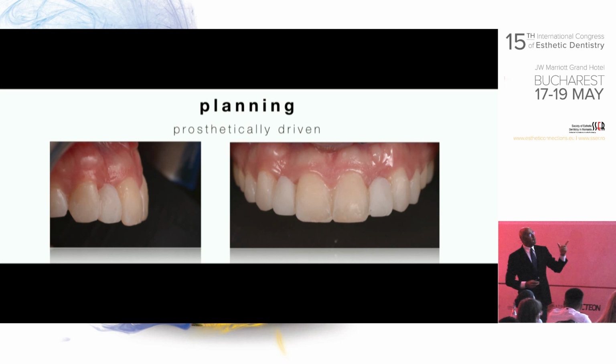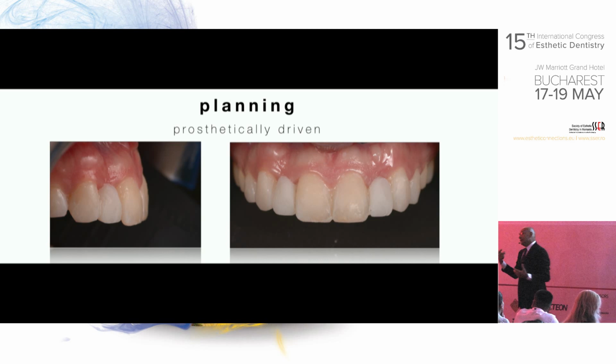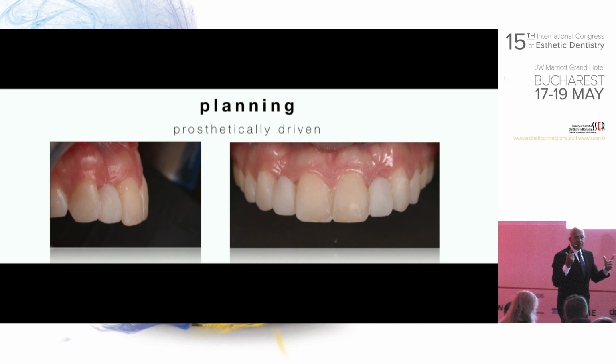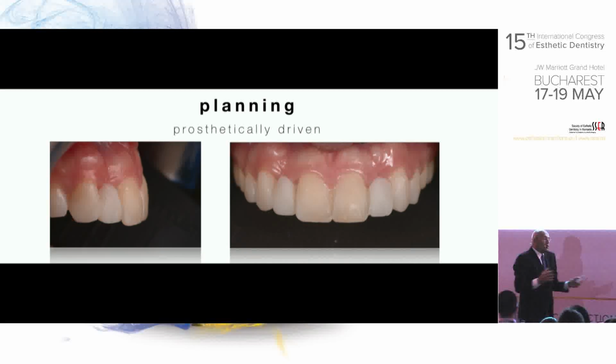Now it's our team's work to work on this backwards and decide where to place the implant, how much soft tissue augmentation to make. This is the right way to go. In most cases, I see that, okay, there's a case with laterals missing. George, I'm sending this patient to you, place 2 implants, send it back to me with no plan, nothing.